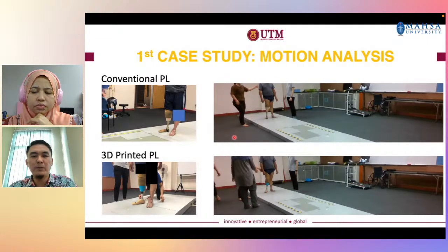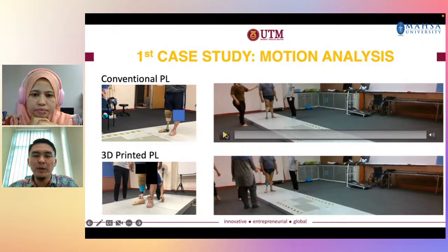Okay, so I will play the video so you can see how we ask the patient to walk on the platform.